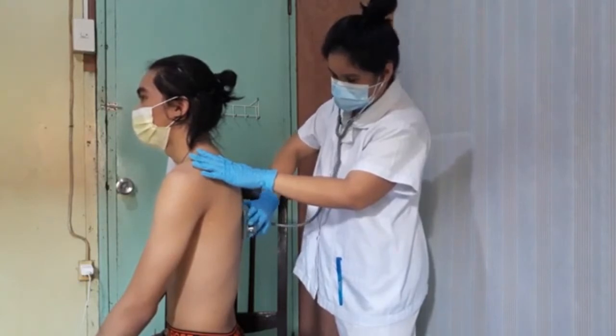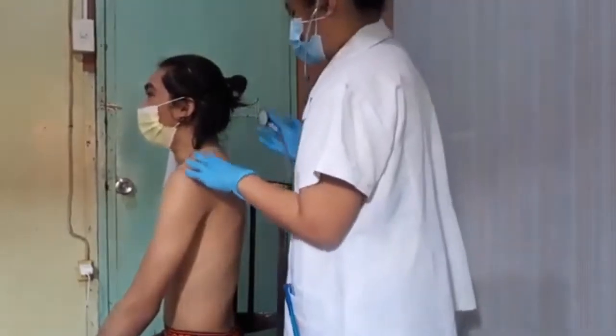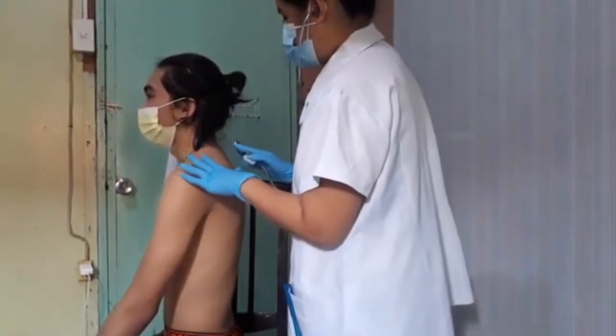Blue moon. Blue moon. Blue moon. Okay, sir, next, every time I place the stethoscope, say E, E, E.